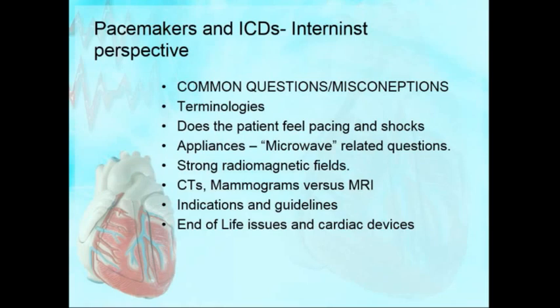Right now, if a pacemaker costs $100, I'm just throwing out a number, an MRI pacemaker will be like $200. So there's a cost. They want to recuperate the investment. So there's cost effectiveness and all this going on. But eventually, all pacemakers and defibrillators will be MRI compatible. Okay?